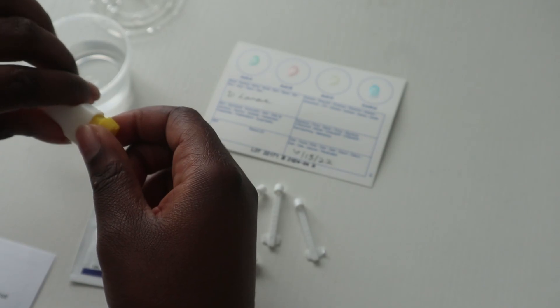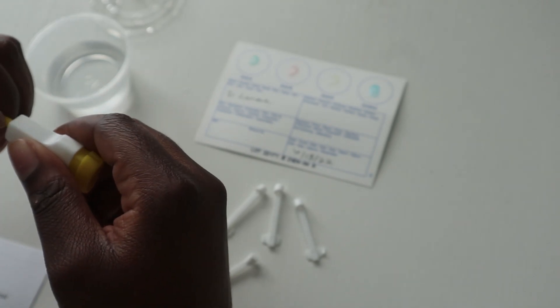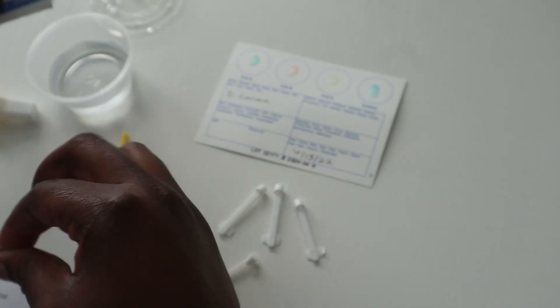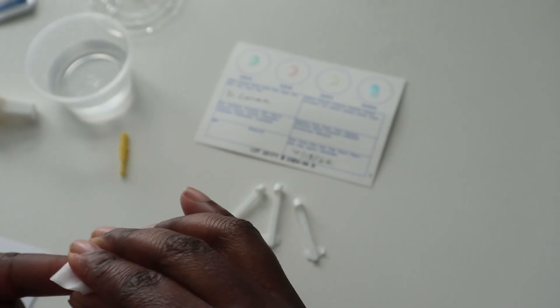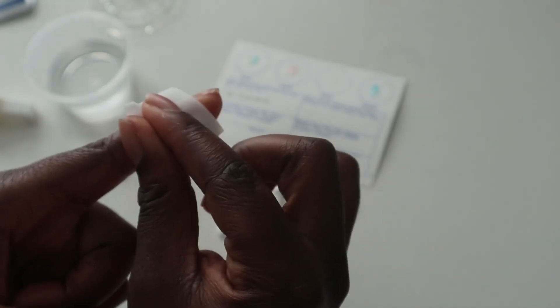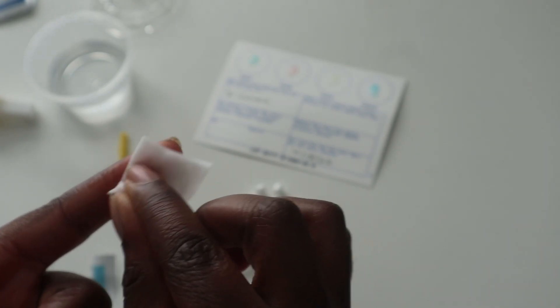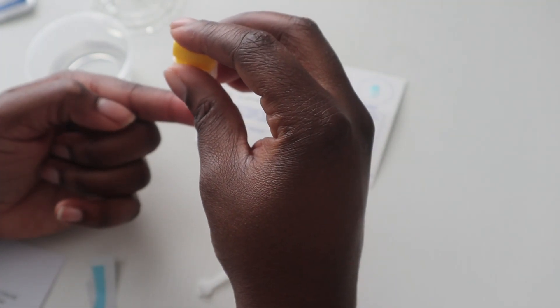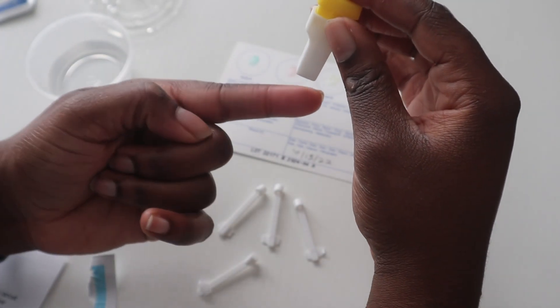Take the lancet and twist the yellow protective cap. Next I will clean my finger, let it dry, then take the lancet and press it into my finger. I'm trying to be careful to go on the side — not directly on the surface of my finger, but on the side of it.